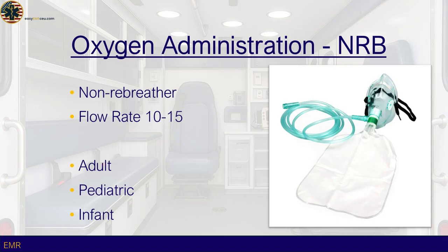NRBs are commonly used for conditions such as acute respiratory failure, carbon monoxide poisoning, or shock, where maximizing oxygenation is critical. EMS providers must ensure the reservoir bag is fully inflated before placing the mask on the patient to prevent rebreathing of carbon dioxide and maintain optimal oxygen delivery. In the pre-hospital setting, non-rebreathers are often the go-to device for patients who require aggressive oxygen therapy but can still breathe adequately on their own.